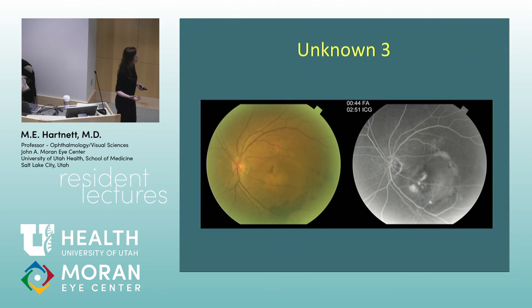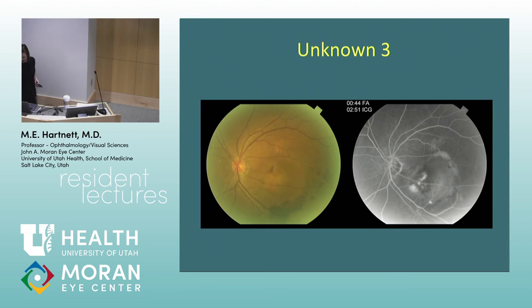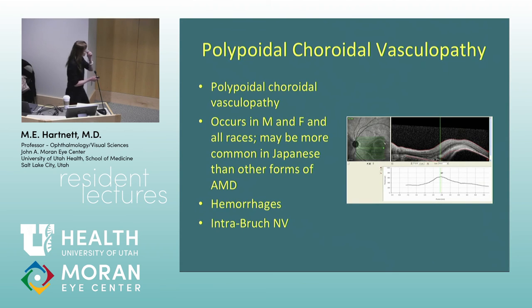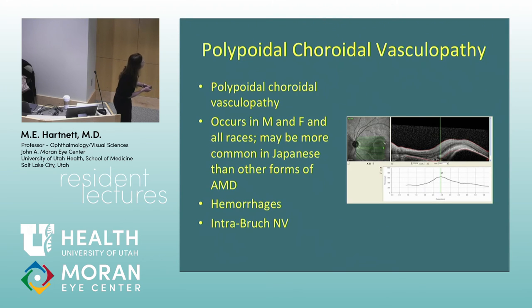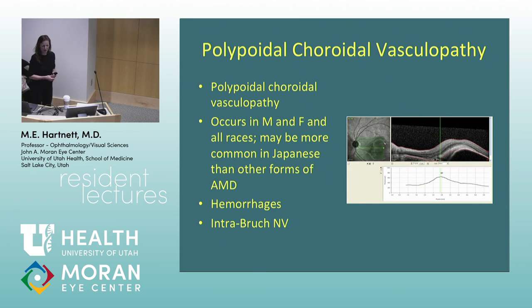Another case associated with hemorrhage, hypertension, and pachychoroid — this is polypoidal choroidal vasculopathy. The image shows the area of the polyp, a sub-RPE hemorrhage, and some exudation above it. It occurs in both males and females. Hemorrhages can be intra-Bruch's membrane, which is somewhat unusual.